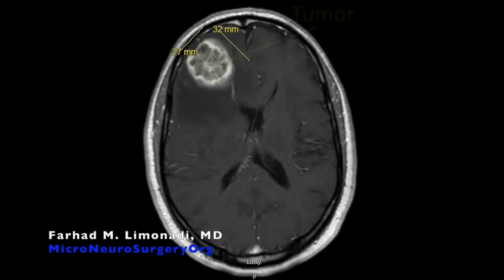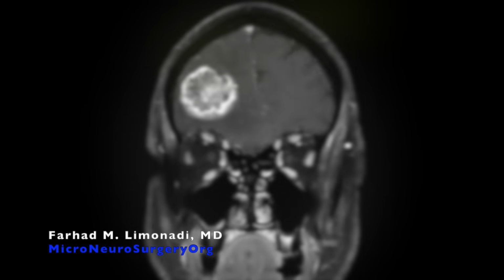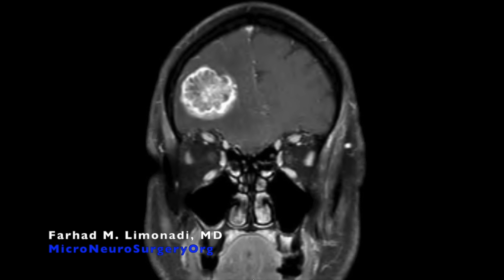MRI scan of the brain showed a slightly greater than 3 cm contrast-enhancing mass in the right frontal lobe with significant vasogenic edema and mass effect, approximately 9 mm right-to-left midline shift, as well as subfalcine herniation.